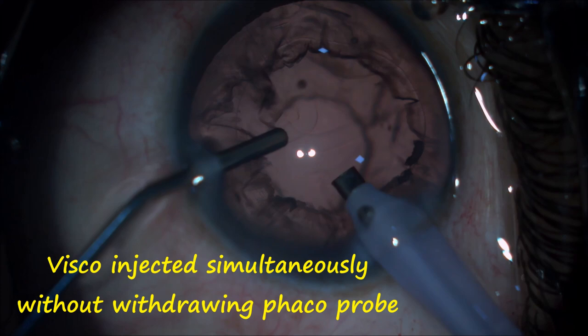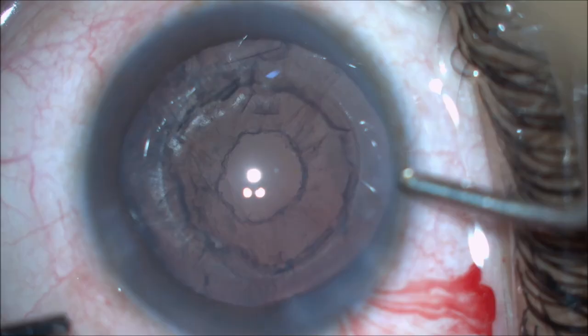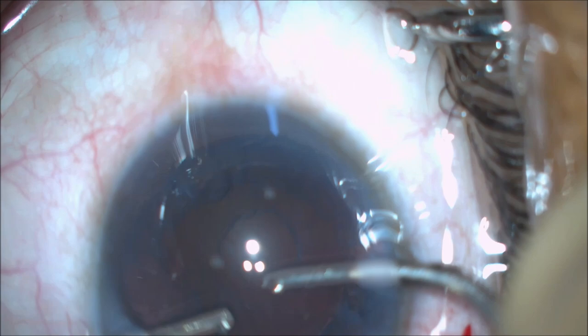After nucleus aspiration, visco is injected simultaneously without withdrawing the FACO probe to prevent the vitreous from thrusting forward, which can result in posterior capsular rupture.